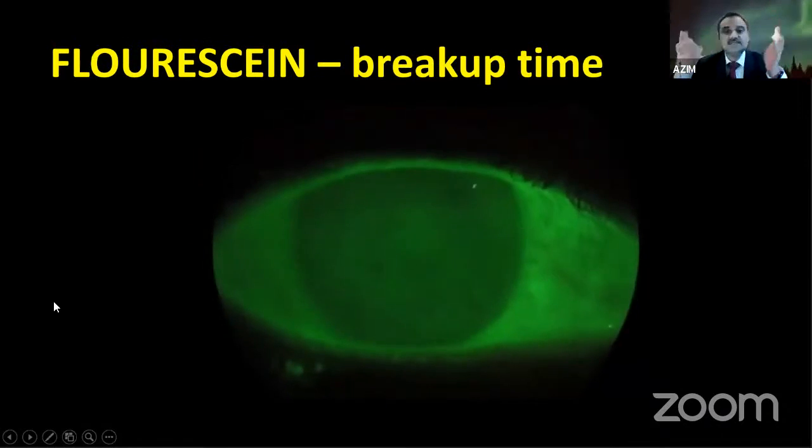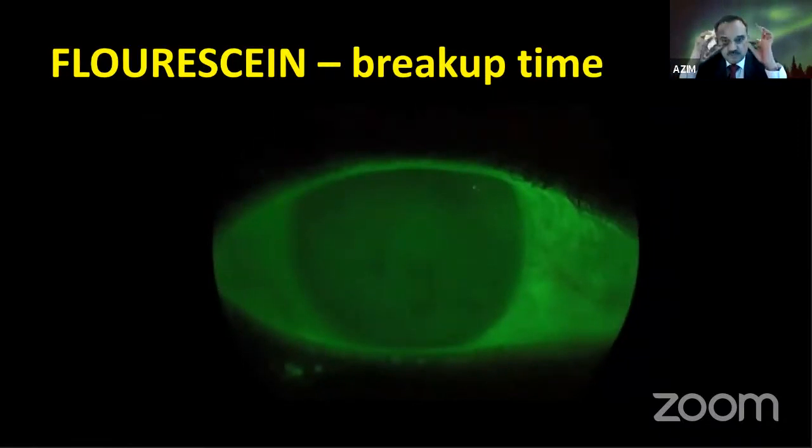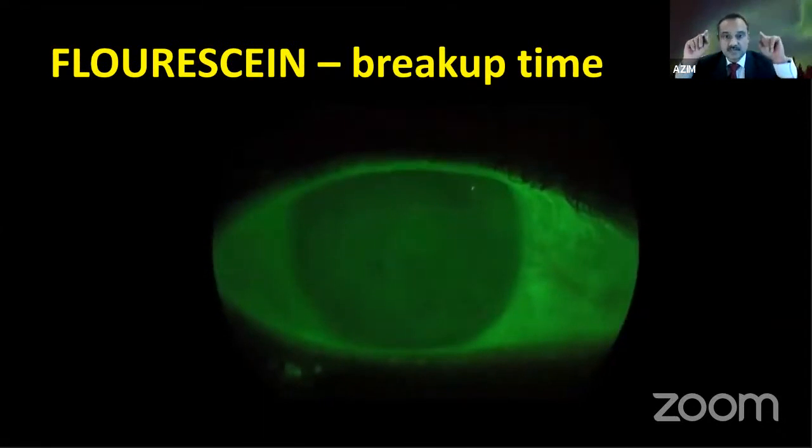Normally you don't see tear film. Tear film is transparent, right? So now if you want to see a tear film, you have to stain it. So normal tear film, when you blink, it remains in the front of the cornea, keeping it cool, like your car windshield wiper. But some patients, it becomes dry very fast. So those patients are not comfortable. They call them dry eye patients.